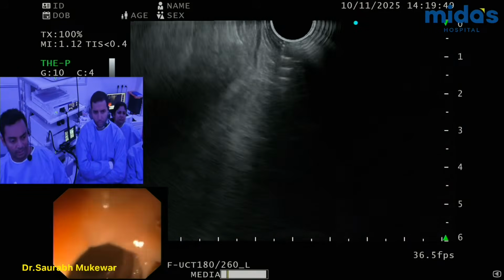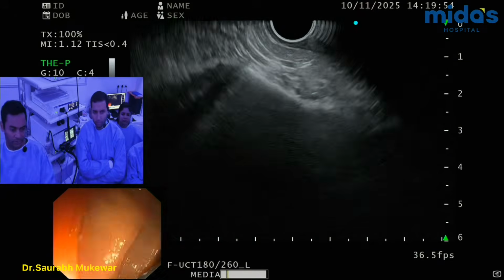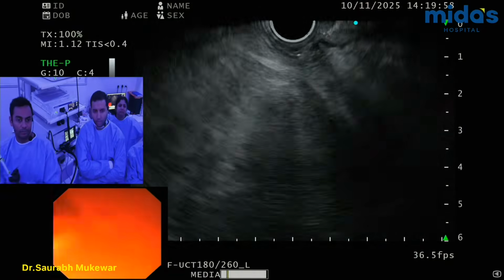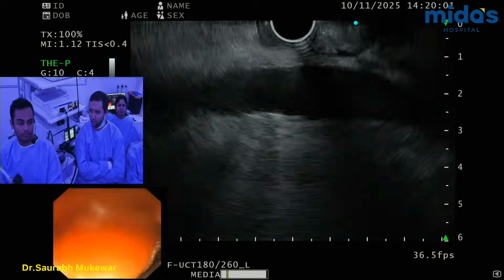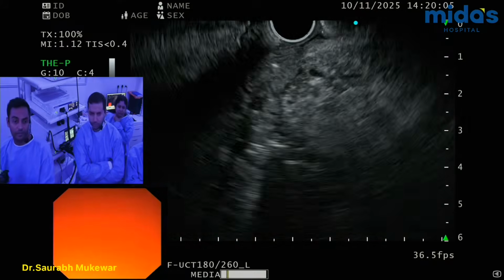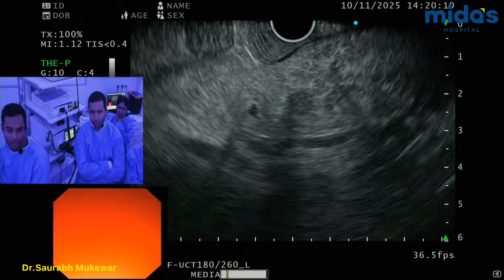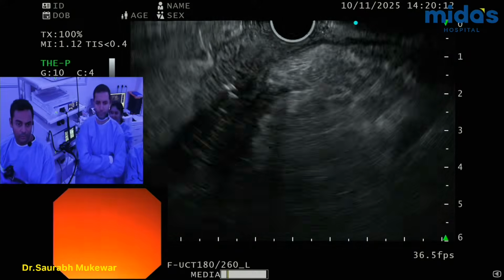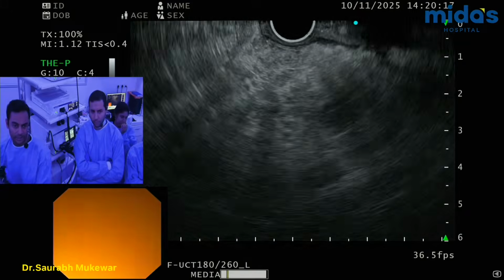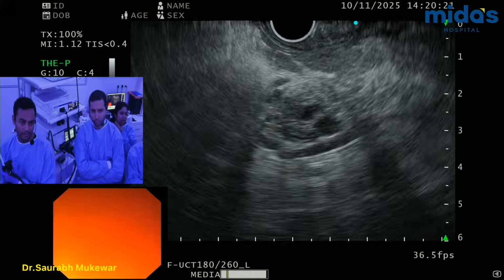Yeah, so I think, you know, as we do more cases, I'll see case to case, I'll be giving particular tips on how to do it. Do you use sometimes the Sonoview in India to enhance the... Yeah, good idea. Good question. In fact, we've not been using it in our unit much. We've seen a little bit of a limited use and cost is a factor. Okay. But I think we should try to do it in sometimes probably NET or some such cases where it can be of benefit. Yeah, okay.